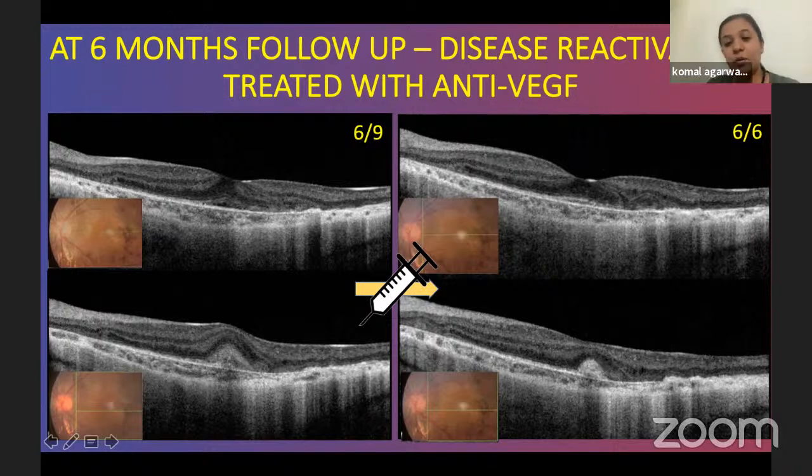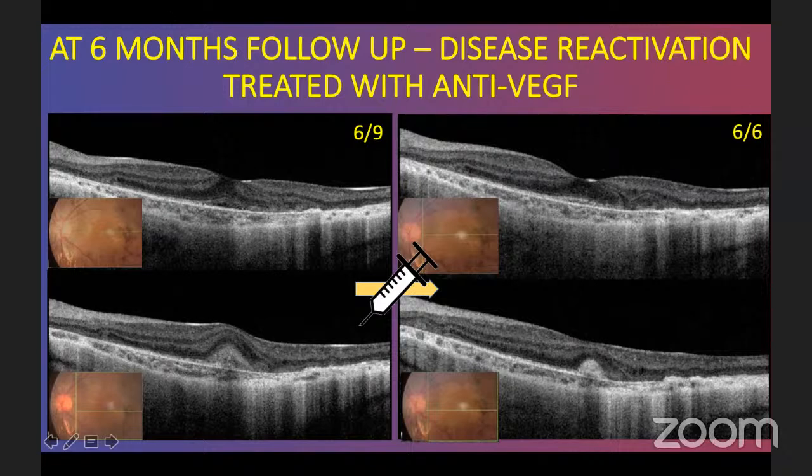Okay. So at the time when you were giving steroids, which were those cases, or what do you see on the OCT? Initially, if you see a lot of SHRM, subretinal hyperreflective material, or hyperreflective foci, these hyperreflective dots, and clinically they are not hard exudates, and they are usually in the outer retinal areas, that indicates there can be some amount of inflammation or a component of PCV. In those conditions I was adding steroids.